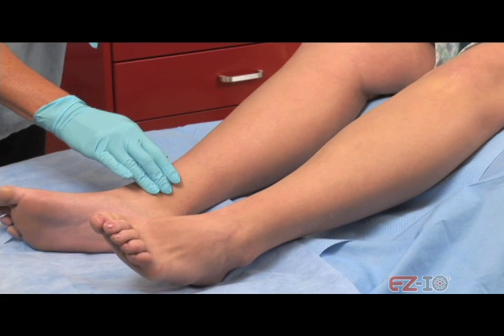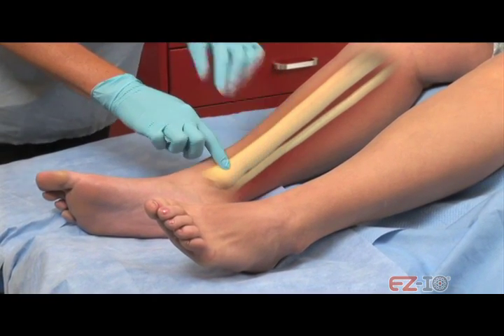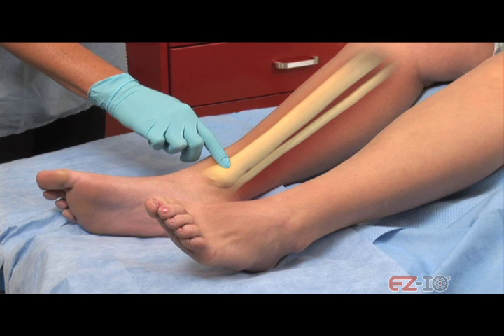The distal tibia insertion site is located approximately 3 centimeters proximal to the most prominent aspect of the medial malleolus, depending on patient anatomy. Place one finger directly over the medial malleolus. Move approximately 3 centimeters proximally and palpate the anterior and posterior borders of the tibia to ensure the targeted insertion site is on the flat center aspect of the bone.